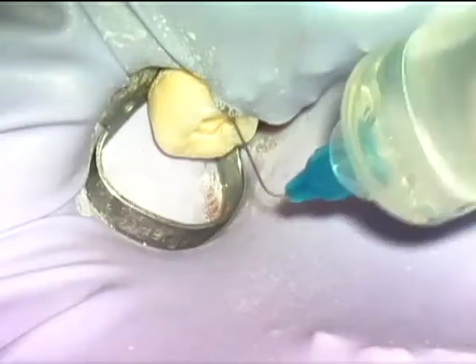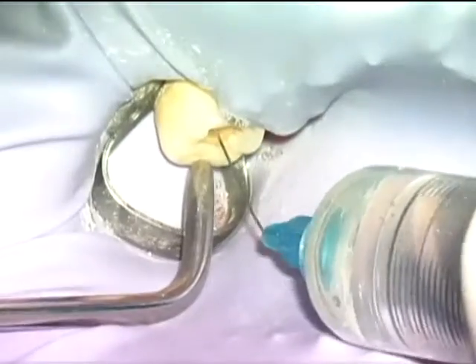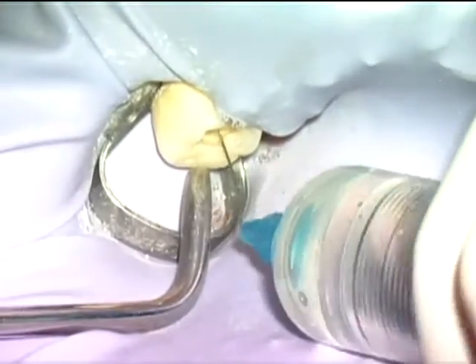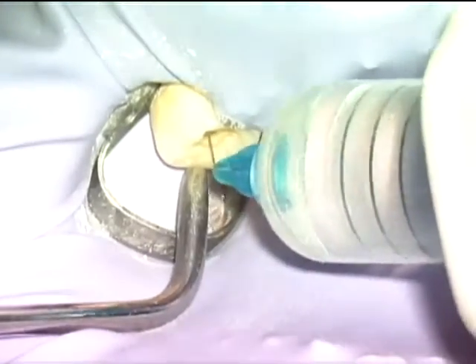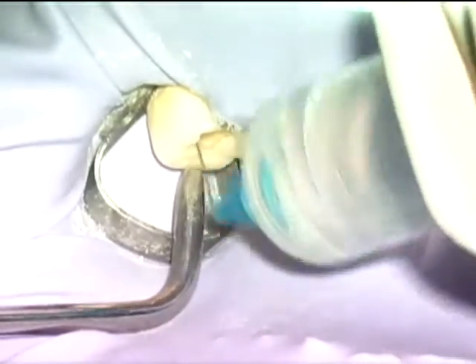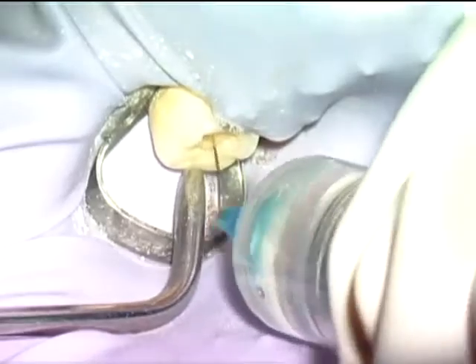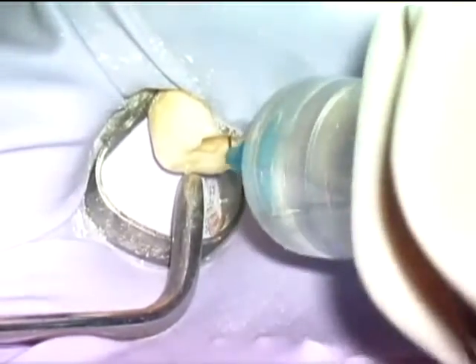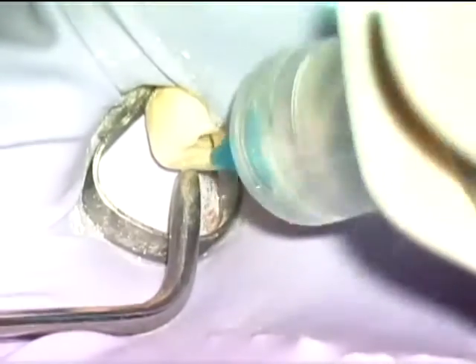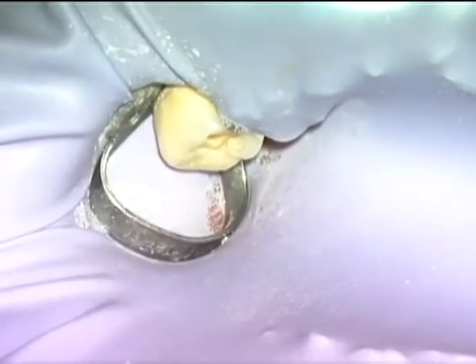The irrigation following final shaping is done with a 17% aqueous EDTA solution or MTAD solution from Tulsa to remove the smear layer on the dentinal walls. Following that, it is important to continue to irrigate with sodium hypochlorite for 15 to 30 minutes to continue cleaning the prepared canals. If that is not feasible, the canals can be filled with calcium hydroxide, the access temporized, and the case can be finished in the next appointment.